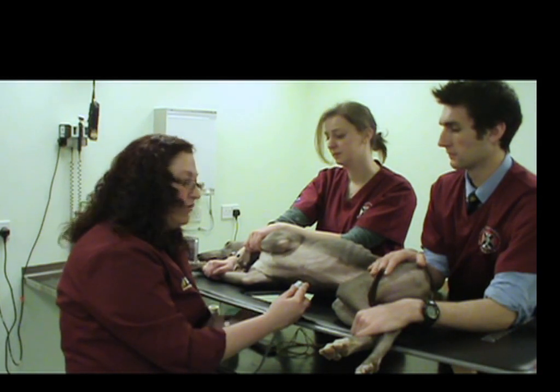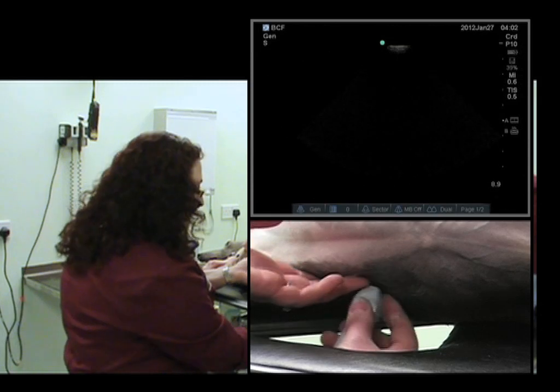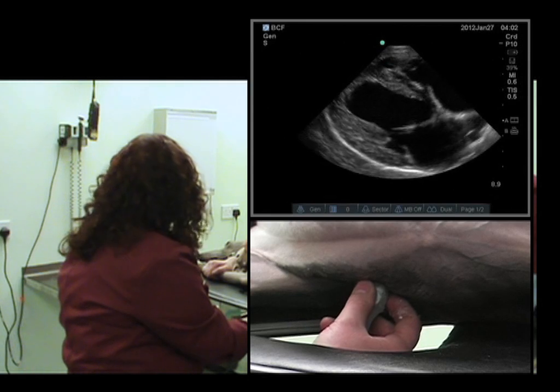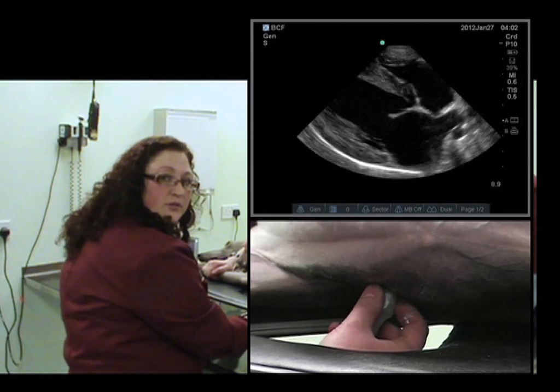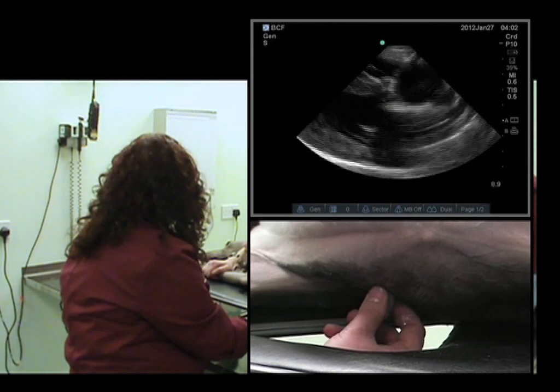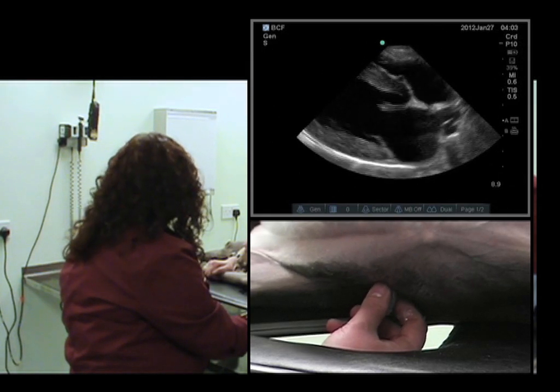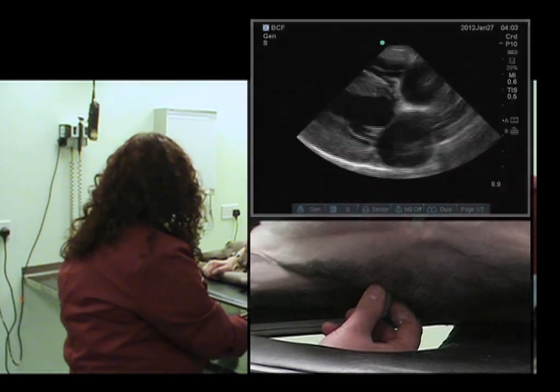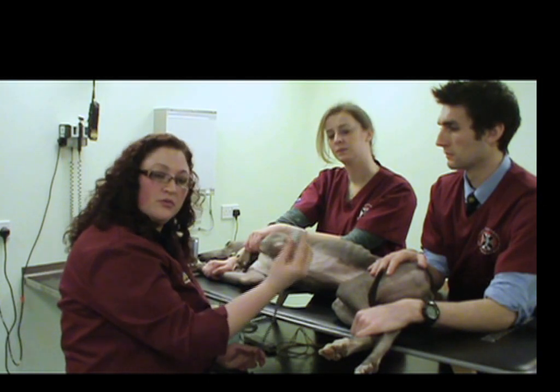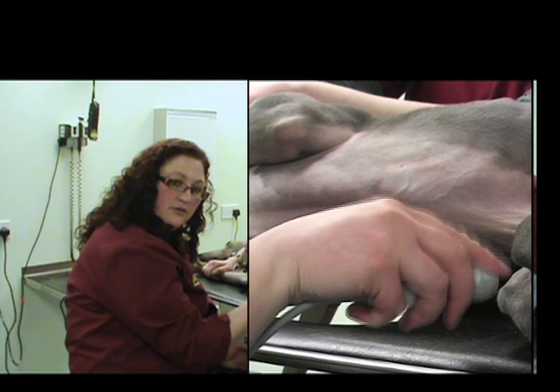We'll go back to the right parasternal long axis four-chamber view to start. I'll feel for the apex beat, go in the intercostal space, my thumb towards the sternum. We're nearly there — we just need to optimize it a little bit. I'll rotate slightly anti-clockwise and fan a little bit in order to get it completely longitudinal. Fanning means very slowly moving the probe in this direction, like you would use a fan.